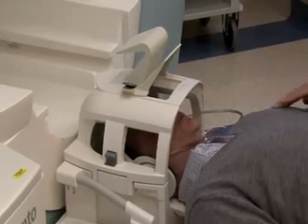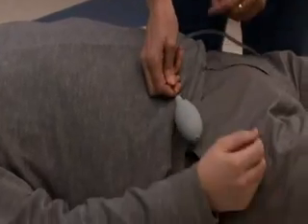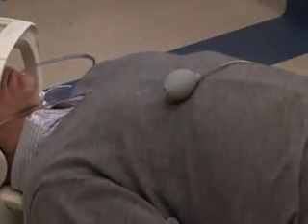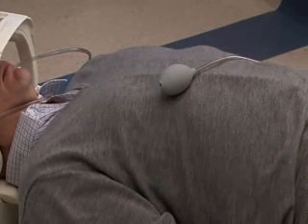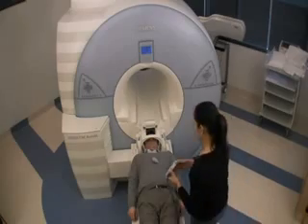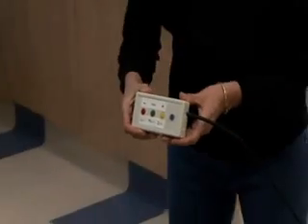How's that feeling? Good. And Phil, if you're feeling a little bit uncomfortable, just give this a bit of a squeeze. There are two things a participant is given just before they enter the machine: a rubber bulb, which they can squeeze to stop the procedure if for any reason they are uncomfortable, and a button box to perform the task they were allocated.